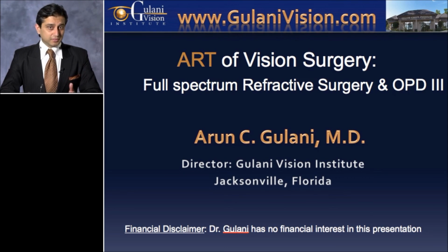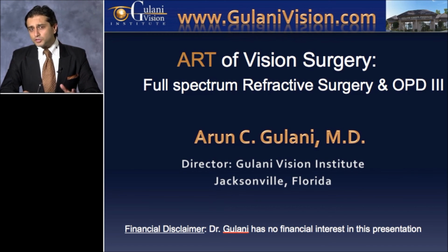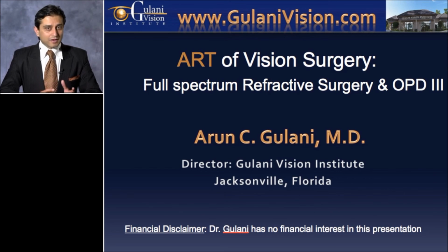So in my practice, which has a unique blend of patients who not only come in for virgin eye surgery, which may be myopic, astigmatism, presbyopia, cataract, there is also a category of patients who come for second opinions and complication correction. I approach every case as a unique situation, not as a complex scenario. And when you approach cases like that, it makes things very simple. It doesn't intimidate the doctor or the patient, and pretty much you get to work coming up with a plan that unfolds in front of your eyes.